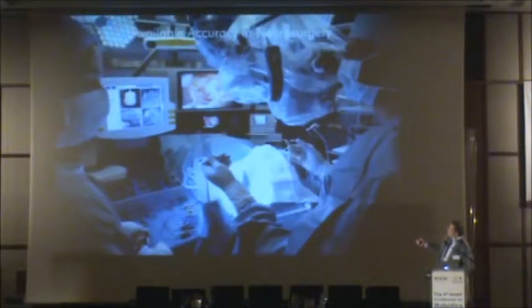What happens there is a camera tracks the position and the orientation of instruments relative to the patient. This is a neurosurgery, so we have the patient's head here. The open skull is possibly covered with some drape here, and prior to the surgery, the patient has received an MRI or CT scan, and then in the surgery, the tracking allows the surgeon effectively to see on the screen where he is with his instruments relative to the so-called medical image data.